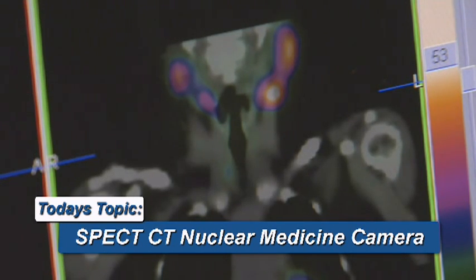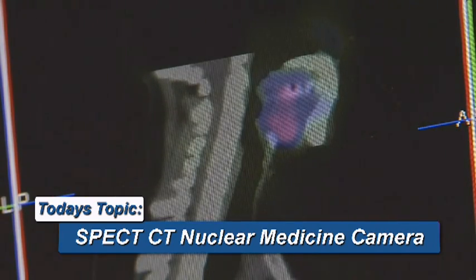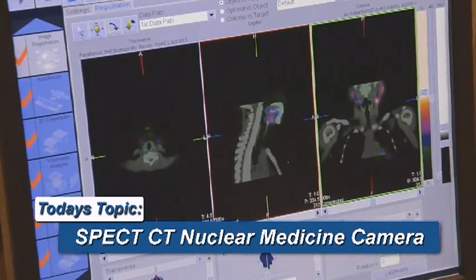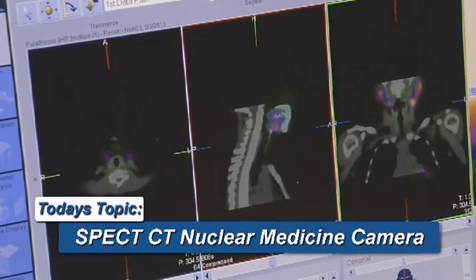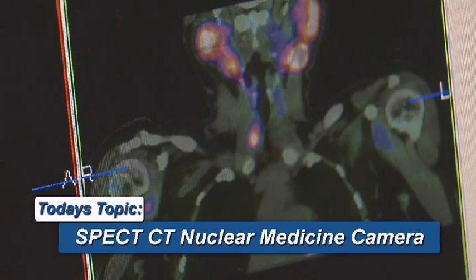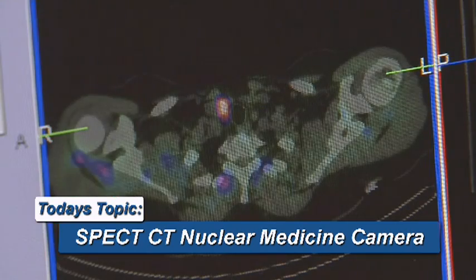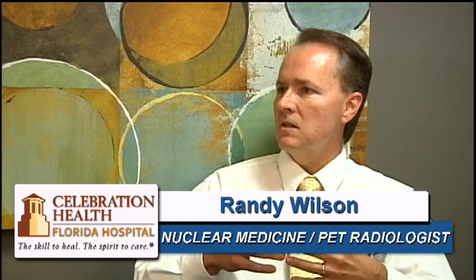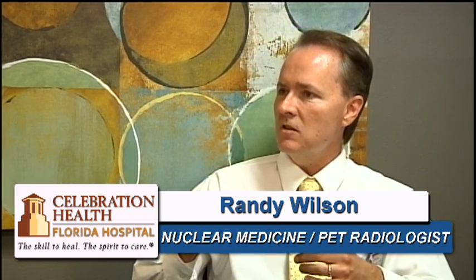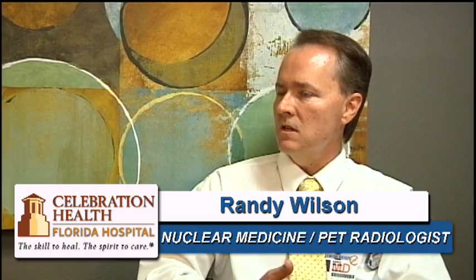You can also do SPECT-CT with a nuclear medicine white blood cell study. With a regular planar 2D image you'd see increased uptake overlying the foot but wouldn't know whether it's an abscess in the plantar aspect or osteomyelitis in the bones. With SPECT-CT, if there's an abscess you'll see the activity in the abscess and nothing in the bone. If there's an abscess with osteomyelitis, you'd see the activity in the abscess and also a focal level of increased uptake in the bone, indicating osteomyelitis as well.